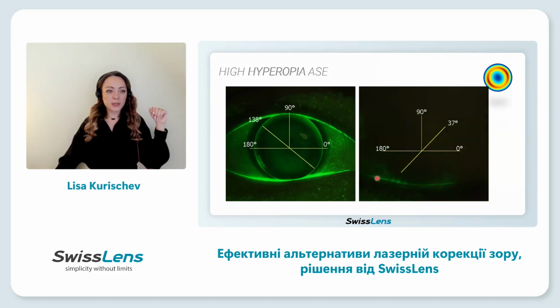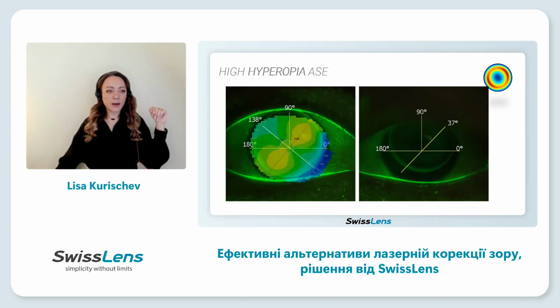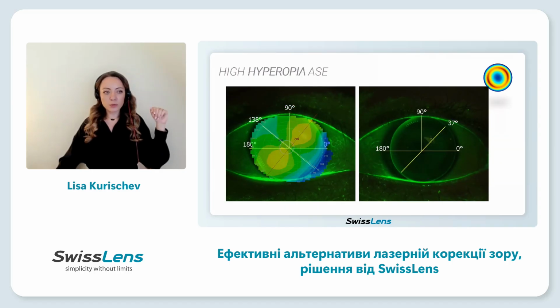You see the points here. And when the lens moves, it's always on the same axis. And here I put the topography from the right eye. Here you can see it's directly on the flat meridian. So of course the patient has good vision and he could wear the lens full day. It was comfortable, good vision, so well done.